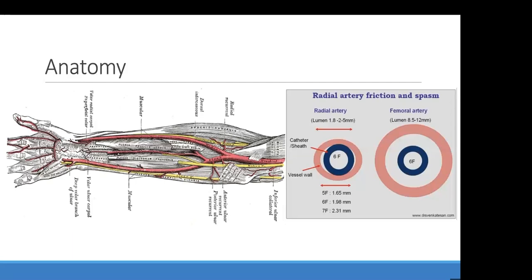So we're going to go across some of the anatomy, the access technique, the complications and challenges. As I mentioned, I wonder if you can see the cursor. Here is the radial lying under the radial bone, and that gives it an advantage. The distal radial is usually around here. They puncture this vessel and branch and go into the radial itself. The ulnar, as I mentioned, doesn't have a bone directly under it. There is a lot of fat and muscle, making it difficult to puncture.